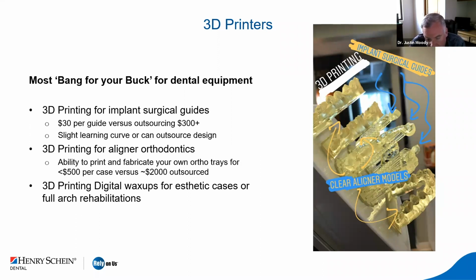We've gone from using third-party companies to create our guides, which used to cost us $300+, to creating surgical guides that have $30 or less in materials. Now remember, even though you only have $30 worth of materials in a surgical guide, that doesn't necessarily mean that's what that guide cost you, because you've got to remember that your time is worth something. So if you can outsource to a team member the actual printing of it, or the post-processing and the curing and things, then you can certainly drive the cost of that down.